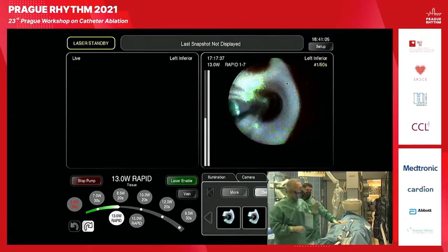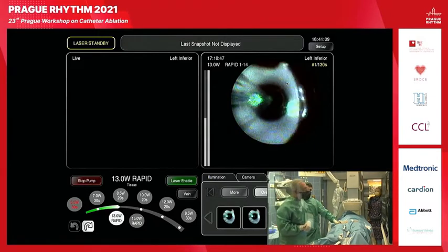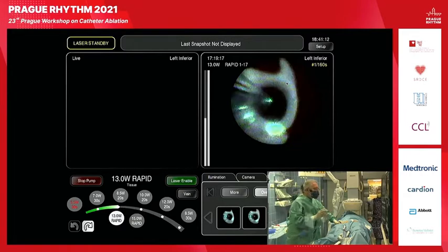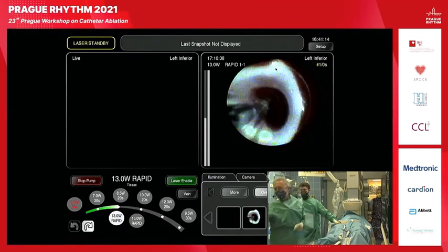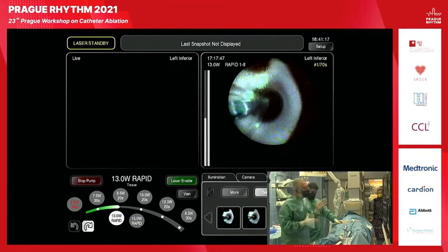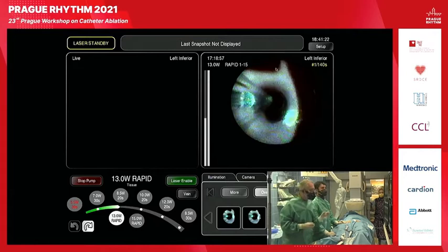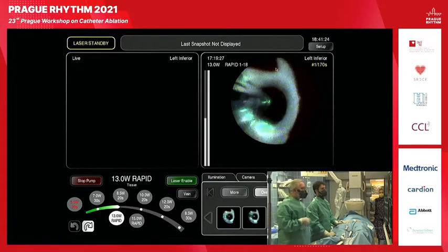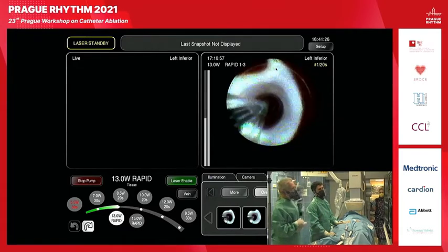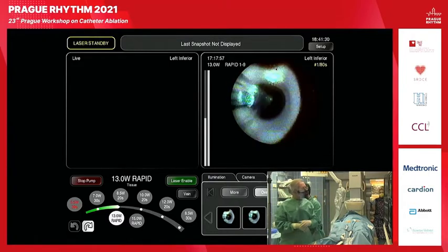What is the most dangerous part of the laser application is to heat inside the artery, the vein. So if you are lasing the stagnant blood inside the vein, it's the most thrombogenic situation. So you need to avoid that; the laser beam should be placed on the tissue contact.